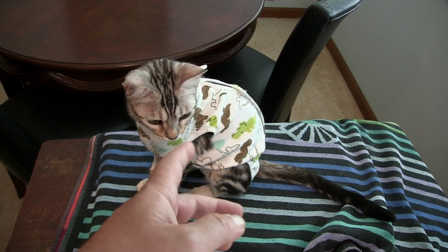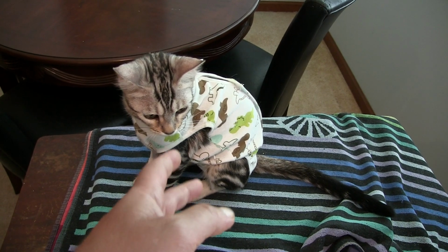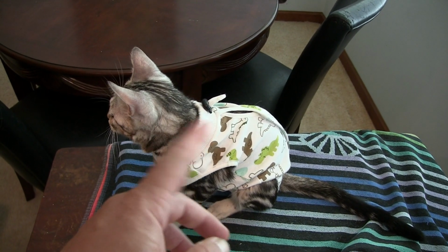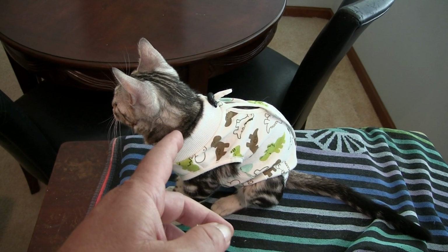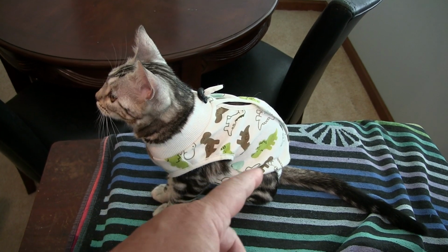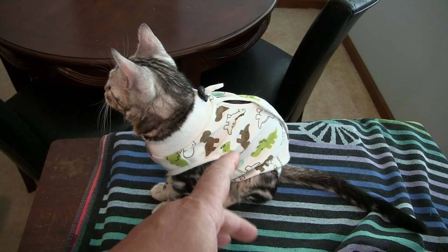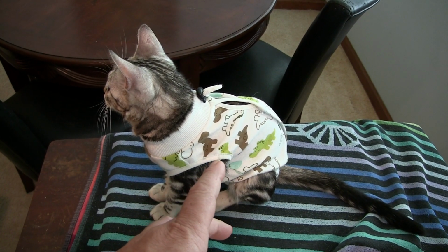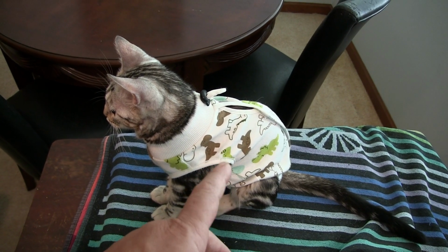Comparing this suit to the collar, just like in life, there are pros and cons to everything. With the collar, they would probably be swaying their head back and forth, trying to get it off, which could put some strain on their neck. The suit doesn't do that. But if they have the collar on, they can't bite any area like under her belly. That's a guarantee. With the suit, there's really no guarantee on that. Since we're here watching her 24/7, the suit is just fine.